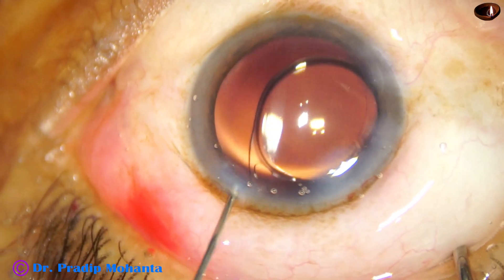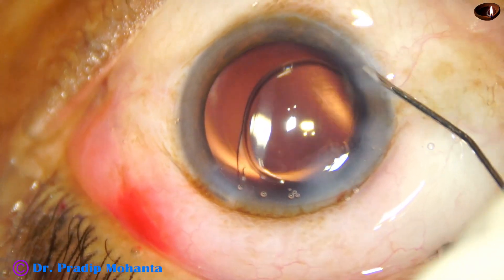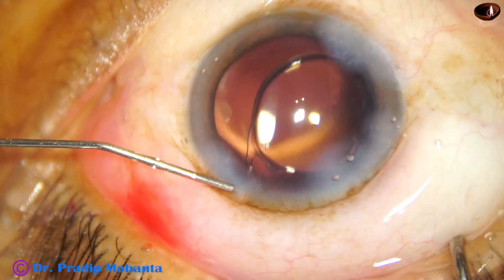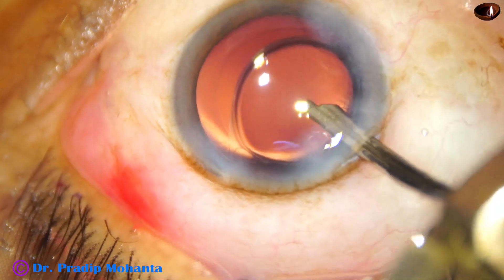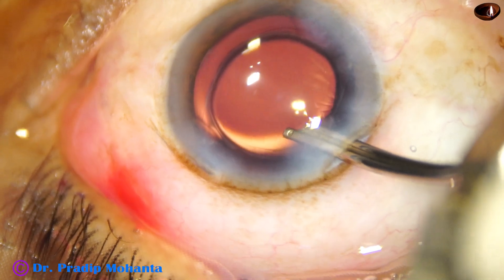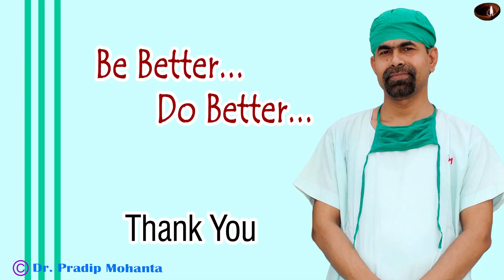Now it is done. This is moxifloxacin. Close the side ports and inject BSS into the corneal stroma — always remain on the scleral side of the tunnel, don't go to the corneal side. Now this is the final lavage until the chamber is nicely formed and the case is concluded. Thank you very much for your attention; I hope this video will help you in doing your initial few phaco surgeries.